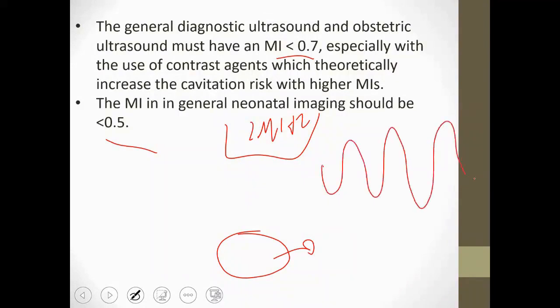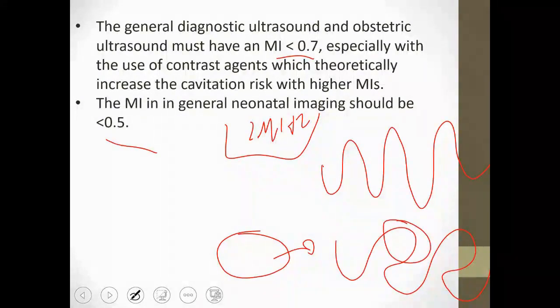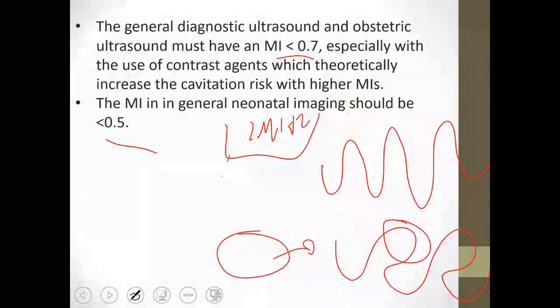This phenomenon results from a complex interaction, causing a substantial change in the pulse. This part is related to the peak of the pressure itself. So what happens is that it causes a noticeable change in the frequency of the ultrasound pulse.